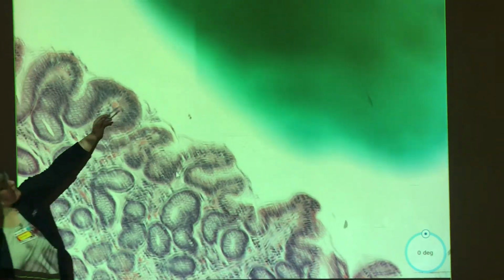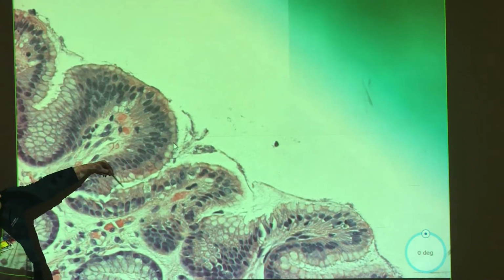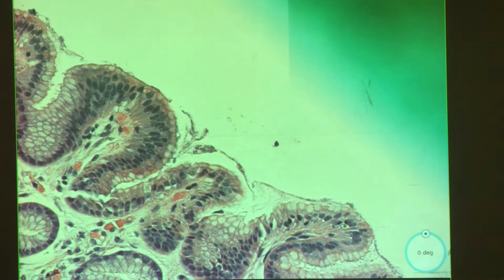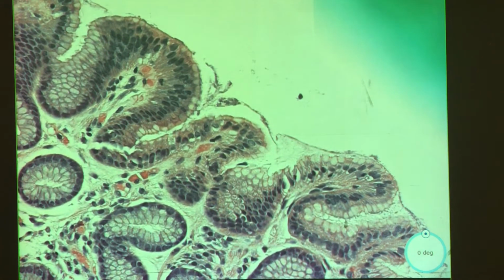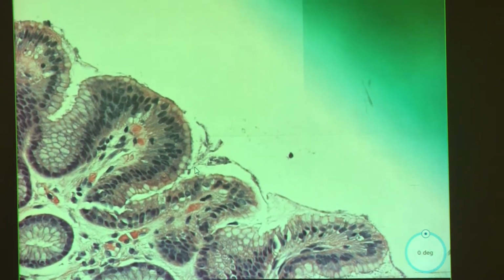What about all this stuff? What is that? It's not projected very well, but what do we spend a lot of time hunting for? Like H. pylori? Yeah. This inflammation is not very prominent, but it doesn't always have to be.